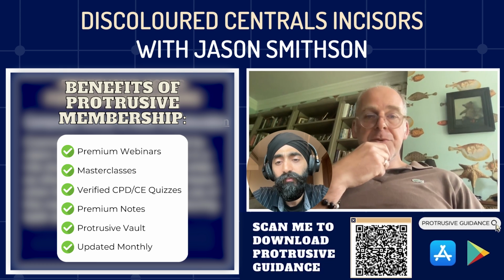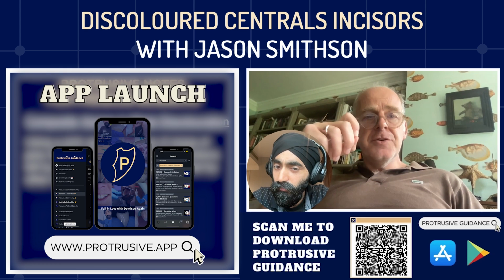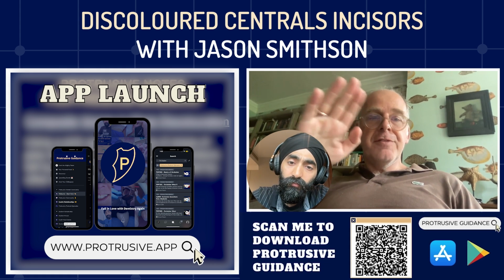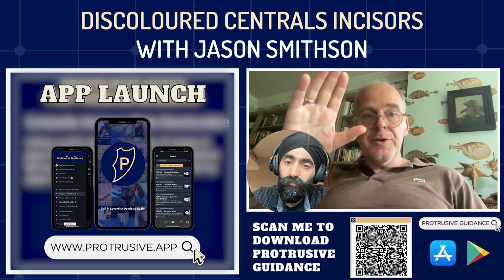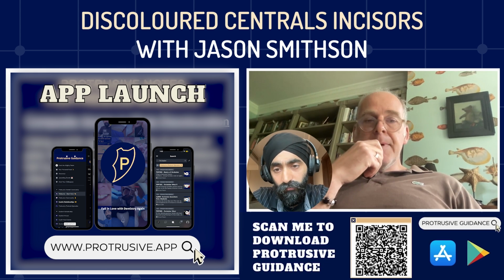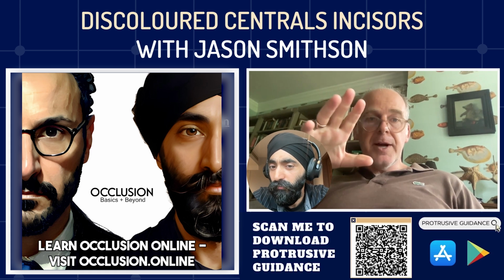The pink, which you alluded to, is actually to get rid of grey. So that's quite useful over the top of, for example, posts, or, less common now, a fractured PFM bridge where you're trying to restore it with composite and hide away the metal. It works very well, but again, pink on its own is often too bright.